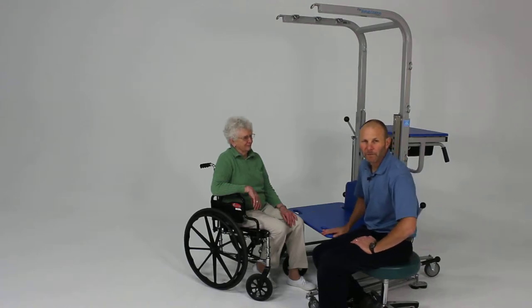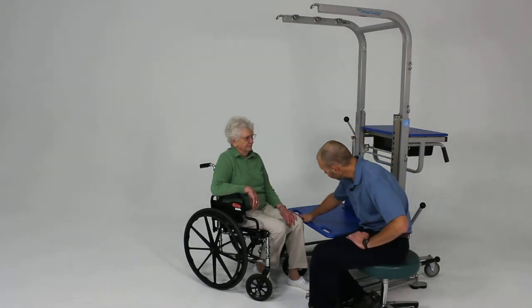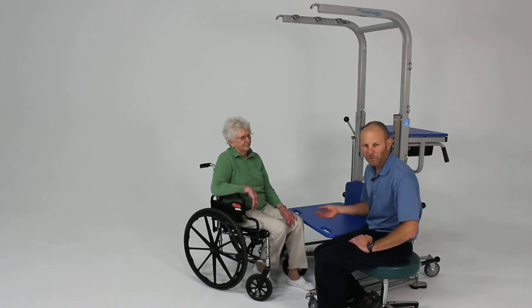A very basic functional activity that the rehab station works well for is just transfers from wheelchair to another surface. Because you have this nice firm platform to work from, and you can also adjust this so that you're right at the same height of the wheelchair. Sometimes in the clinic environment, if you're at a bed, a non-adjustable mat table, or the surface is too soft, it'd be hard to practice that.